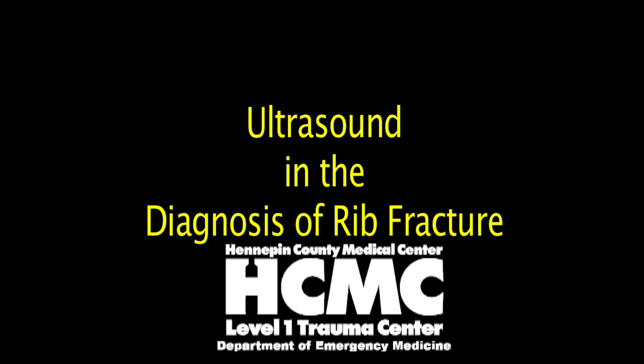Welcome to the HCMC training video on the use of ultrasound in the diagnosis of rib fracture. Until now, the diagnosis of rib fracture was made incidentally on chest x-ray, by exclusion, or clinical exam. By using the ultrasound to confirm the diagnosis, one can be more confident in the diagnosis of rib fracture, and therefore more assured that there is not a more serious underlying cardiac or pulmonary pathology.